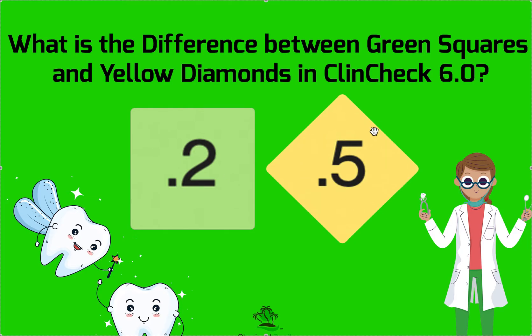The yellow diamonds mean IPR — that's something you have to do. It's an action item. You have to do the IPR before it turns yellow. The yellow diamonds are clear until they're due, and then they turn yellow. And remember, you don't have to do them on their due date — you have to do them before they are due. They're like a library book: get them done before they're due.